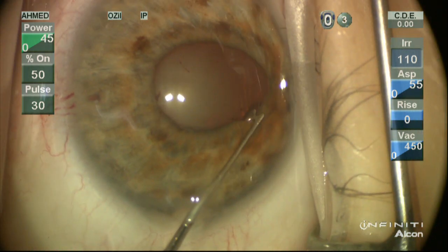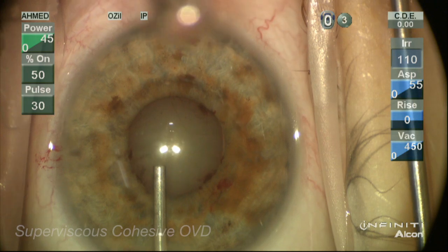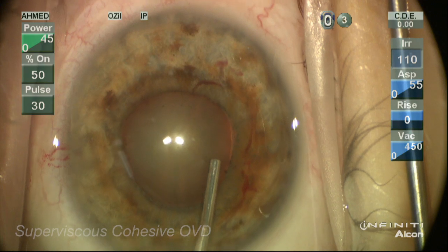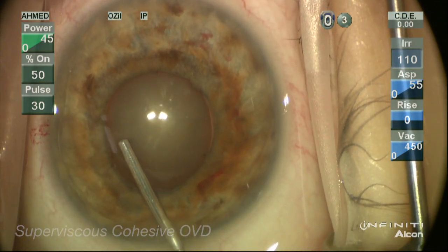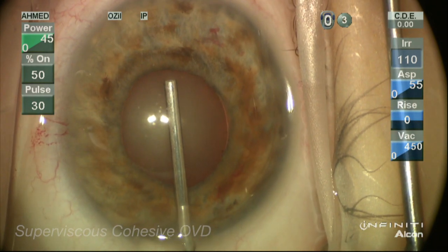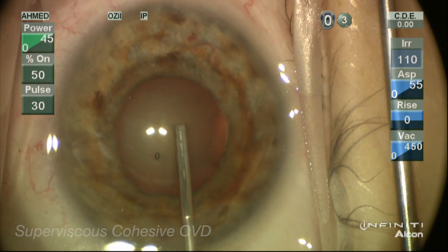We'll take a peek at the lens periphery to make sure there's no obvious overt zonular dialysis. Here we're using Helon 5, a super viscous agent, which is an excellent agent to not only deepen the chamber but also to expand the pupil in a visco-mydriatic fashion, as well as flatten the anterior capsule to allow us to perform a safe capsulorrhexis, which will need to be done at or just beyond the pupil margin.